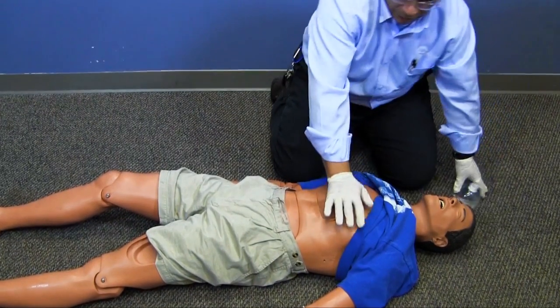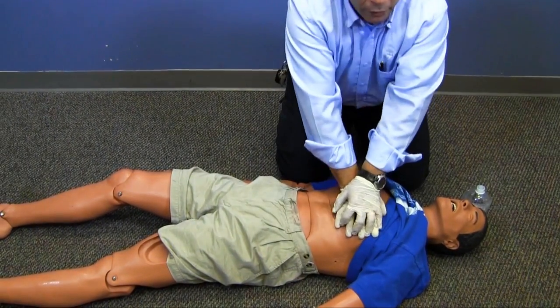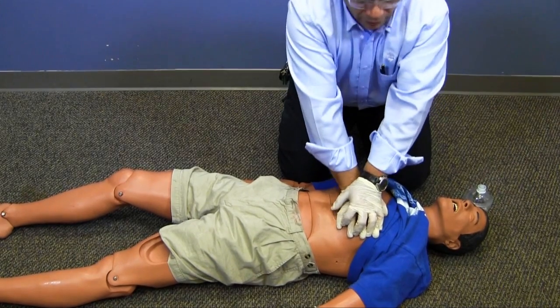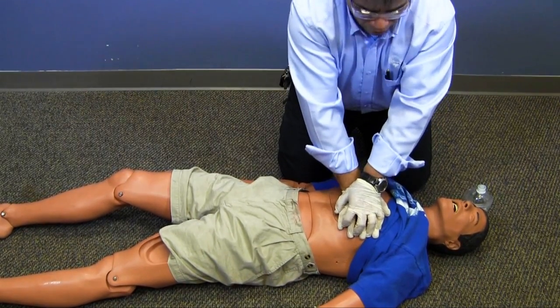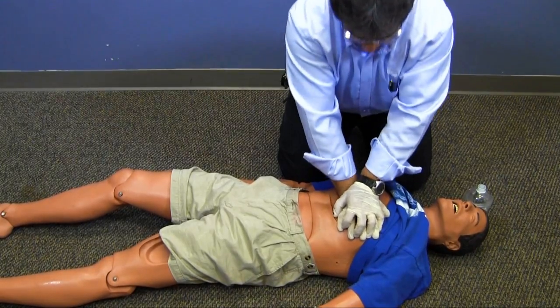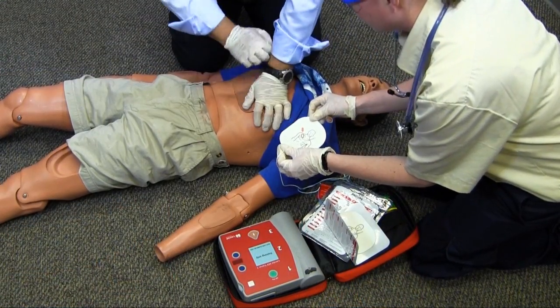When I ventilate, I provide adequate volume for each breath, looking for chest rise. When I stop to provide ventilations, I do so with minimal interruptions of 10 seconds or less.